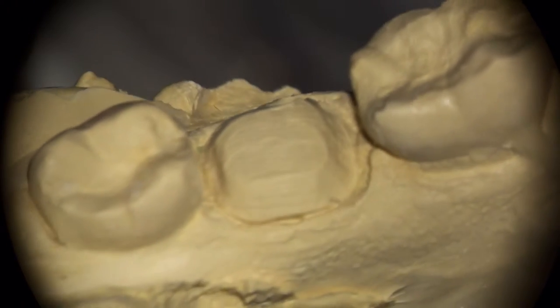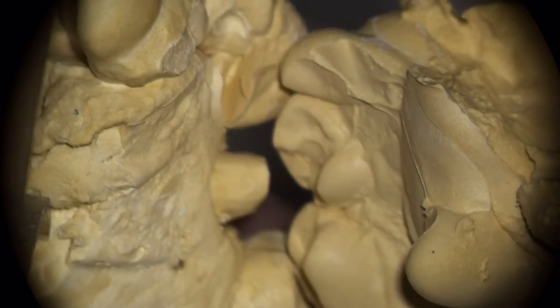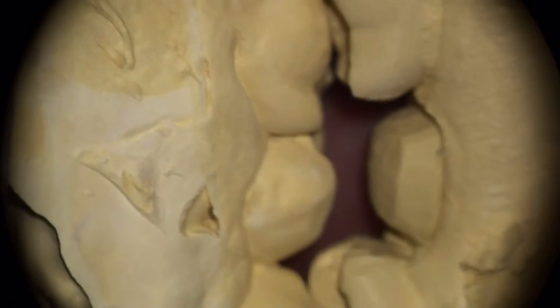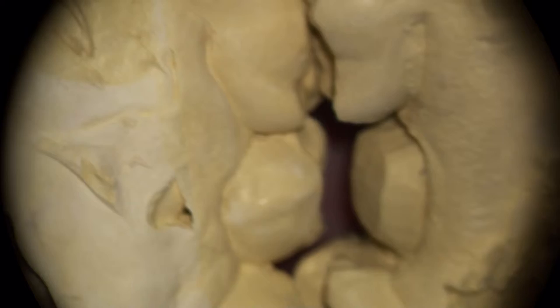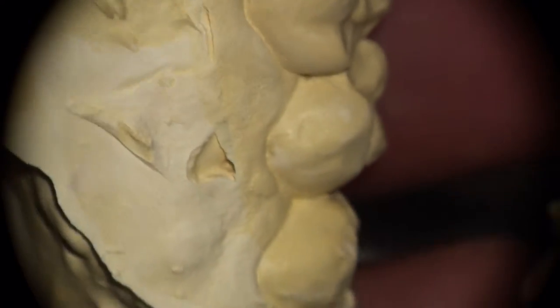And another nice thing about this one, the reason this one's articulated, is because we're also doing the opposing arch, a molar on the opposing. So the good part is the teeth aren't opposing one another, because that gets to be a little bit more complicated. So we have that tooth up there, and we got this tooth back here, and so you don't have to worry about fitting them to one another. That's always a little additional complication, but easily handled once you figure out which way to go.